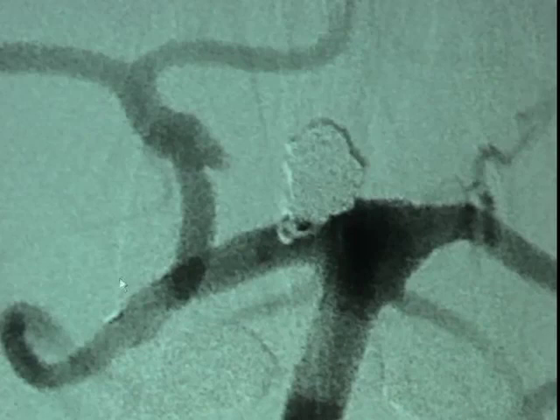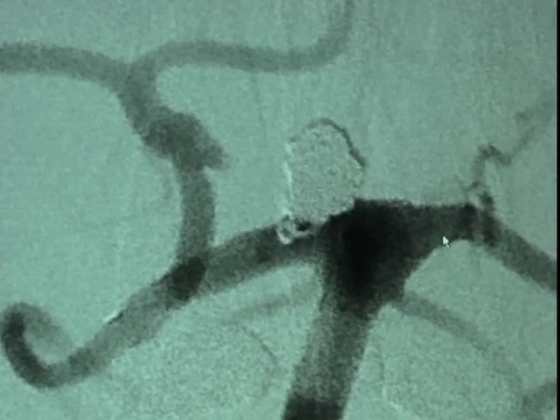This shows one end of the stent in the right posterior cerebral artery and the other end of the stent or neck remodeling device in the left posterior cerebral artery. Here's the aneurysm at the edge of treatment. The stent extends across through the vessels, across the base of the aneurysm, and there's no residual filling of the aneurysm. The arrow points to the area that had been filling with contrast and blood previously. Here the two arrows point to the two ends of the stent.